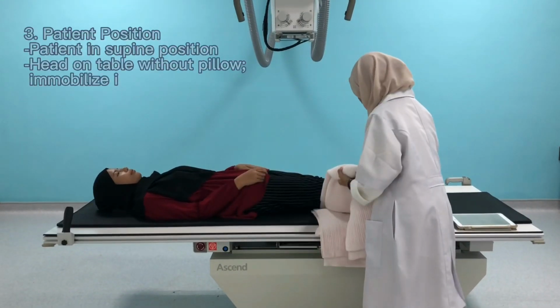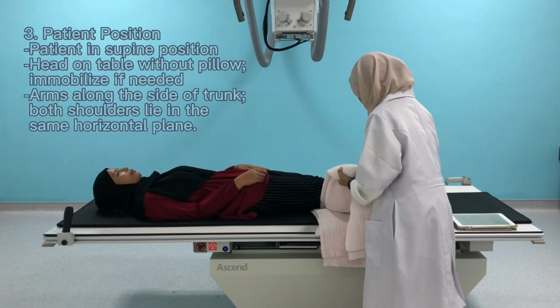For patient position, the patient must be in supine position with the head on the table without a pillow or with a sponge for head support, and the arms along the side of the trunk, and both shoulders must lie in the same horizontal plane.